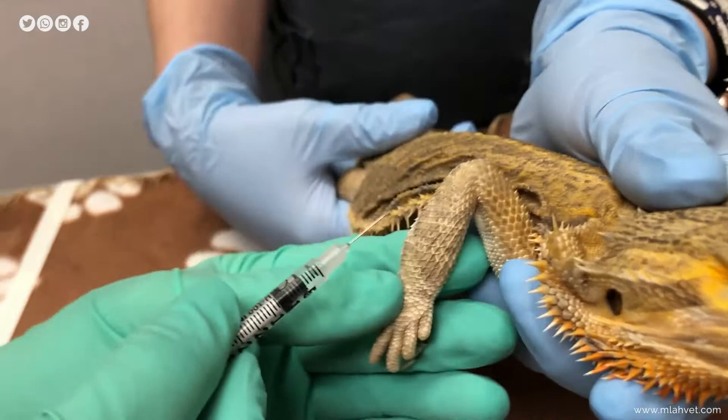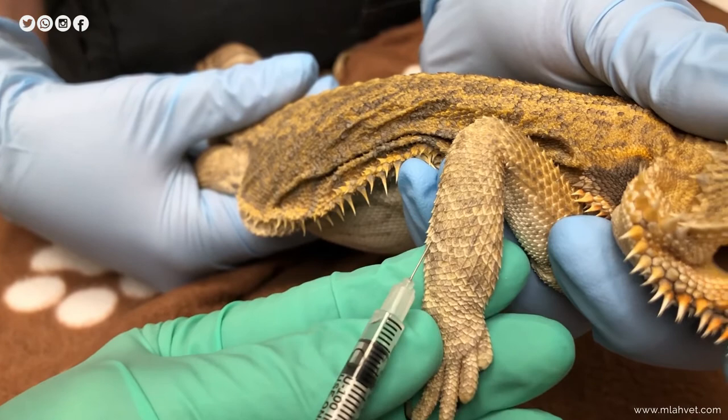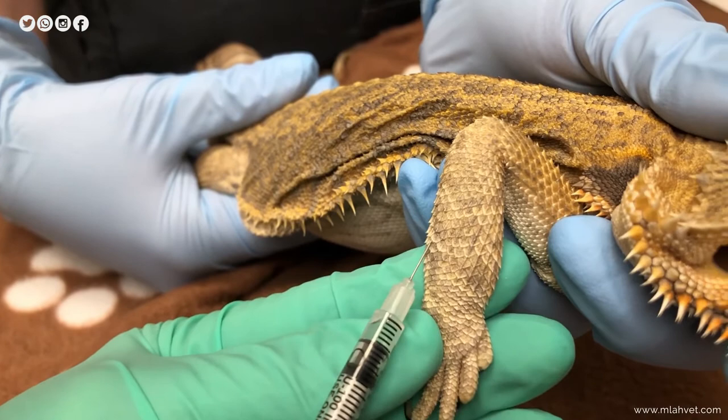I'm just going to line up my needle with the bevel facing up, go in between the scales, and inject. I put my finger on top and you're all done.